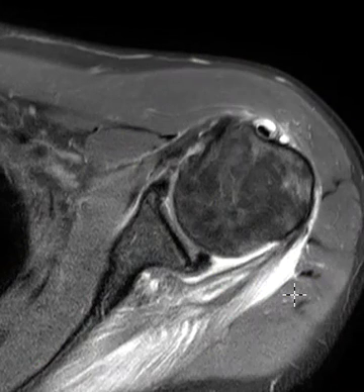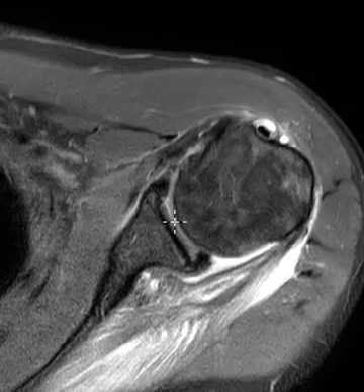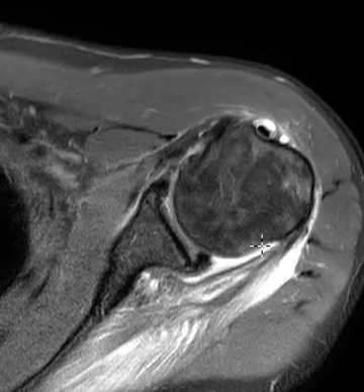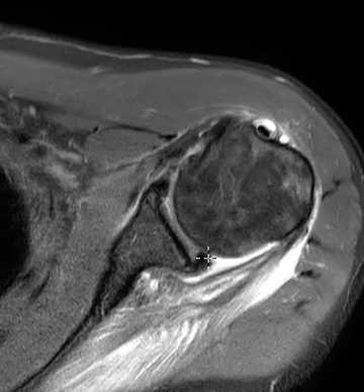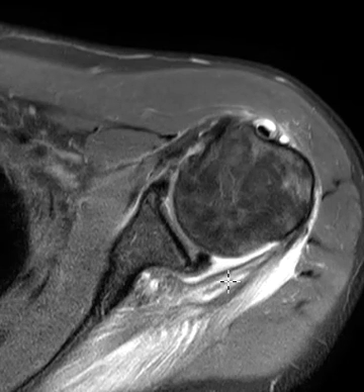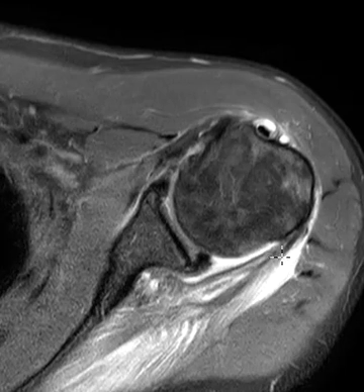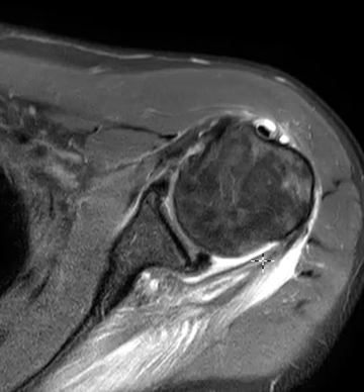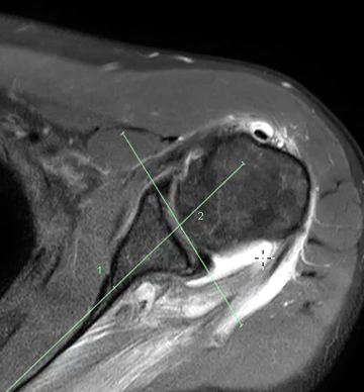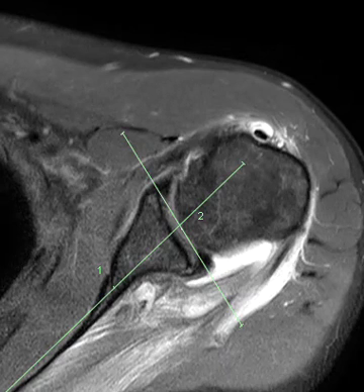When they're retroverted like this, the humeral head can sublux posteriorly. They have posterior shoulder joint instability and can have tears of the labrum posteriorly. This patient — we found this incidentally — they had some other significant findings, including a rotator cuff tear and some other things, but this is just a simple case of retroversion of the glenoid.